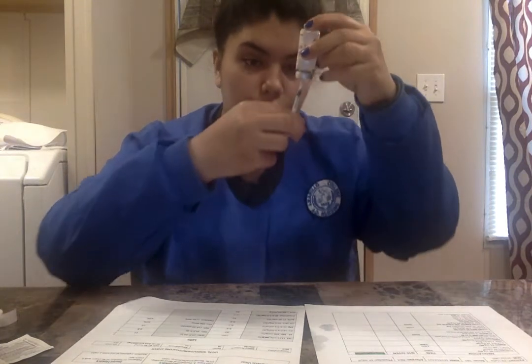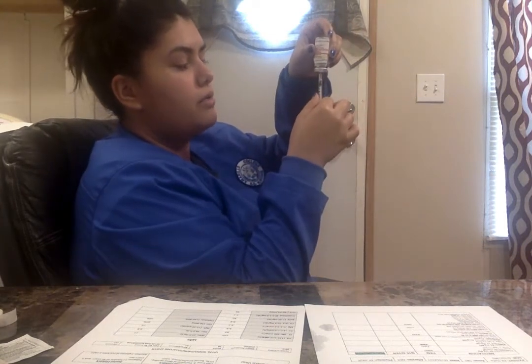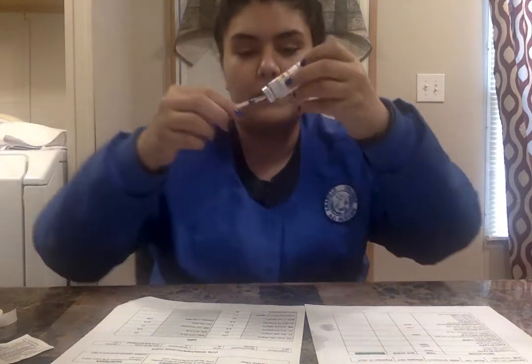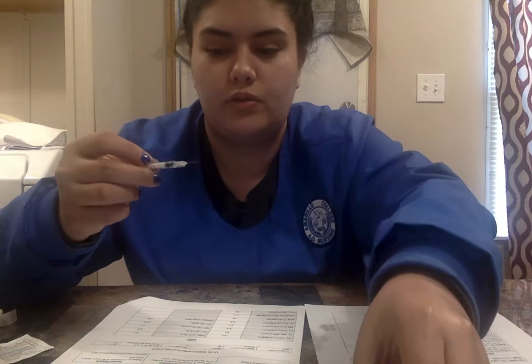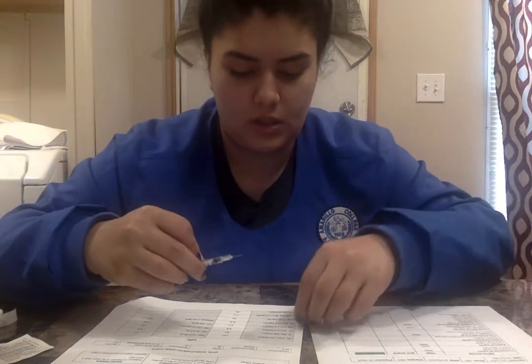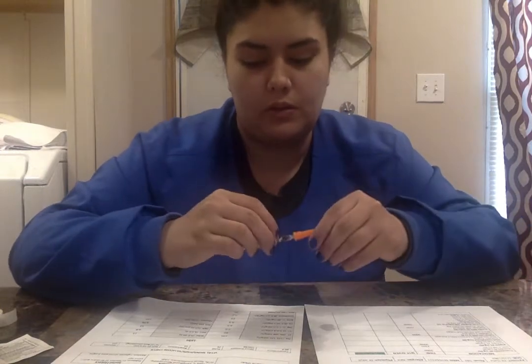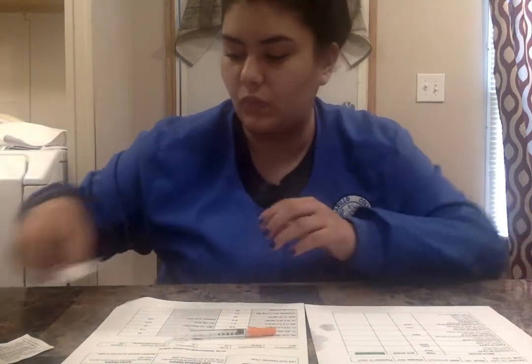We are going to show our second nurse. She comes over. She says, yeah, that is 2 units. And so that's okay. And so we go ahead and take this out. We're going to use the swoop and scoop method. We are going to recap our needle. And we are going to label our insulin.